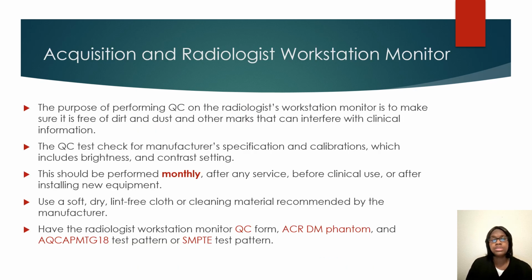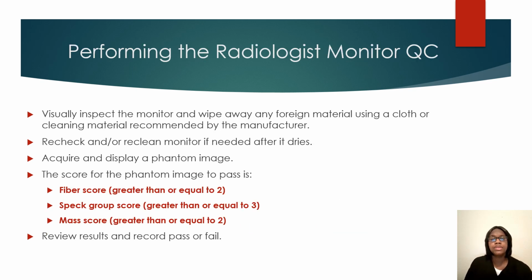And then you also want to do the same thing with the radiologist workstation monitor. This should be tested monthly, after any service, before clinical use, and after installing new equipment. To perform the radiologist monitor QC, you want to visually inspect the monitor and wipe away any foreign material using a cloth or cleaning material that is recommended by the manufacturer. Recheck and/or re-clean the monitor if needed after it dries.